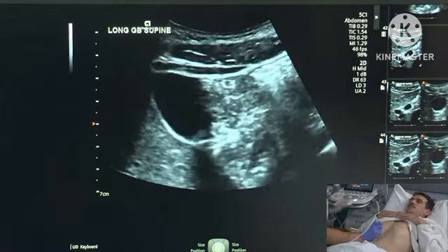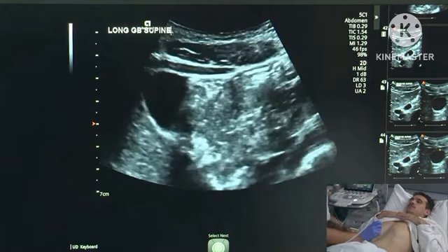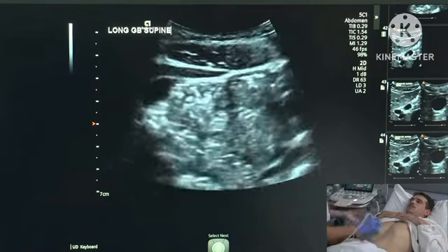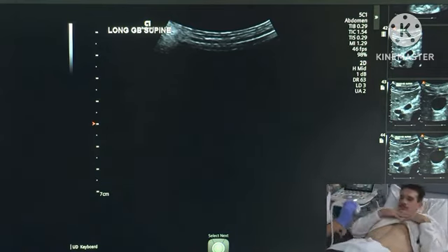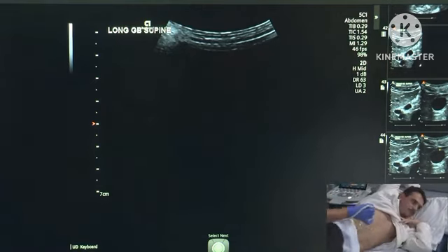All good. The next thing that we need to do when we assess the gallbladder is assess it in a different patient position. So supine and left posterior oblique mean that our neck is going to be the most dependent portion. When we turn our patient into decube or have them erect, the fundus will now become the most dependent portion. So can I just get you to turn all the way onto your side so that you're facing the wall away from me? Good. And now just scoot your body back so you're closer towards me on the edge.